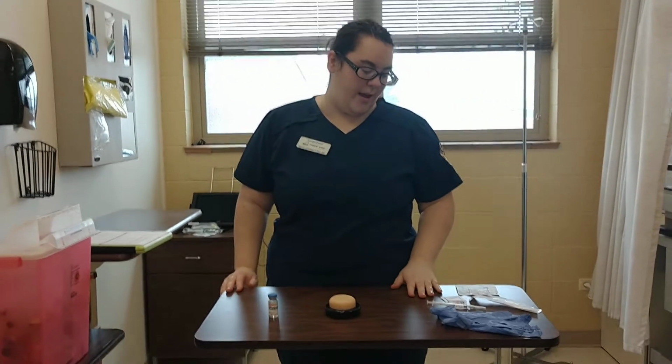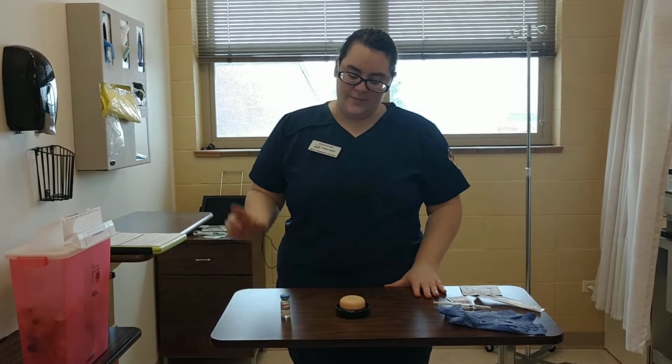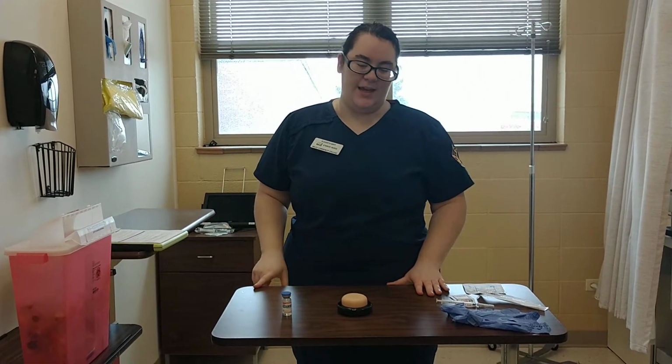Alright, we're going to be doing an intradermal medication today. First I'm going to gather all my supplies, make sure I have a 1 ml syringe with a 27 gauge needle. I'm going to administer medication via the 6 rights, and the 6 rights are the right dose, the right time, the right route, the right person, right medication, and right documentation.